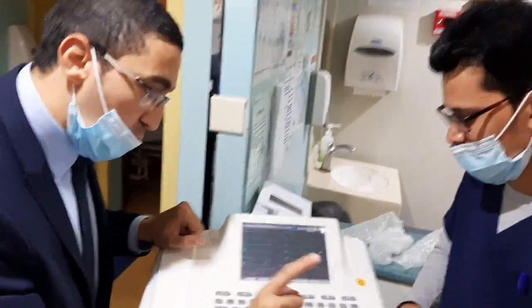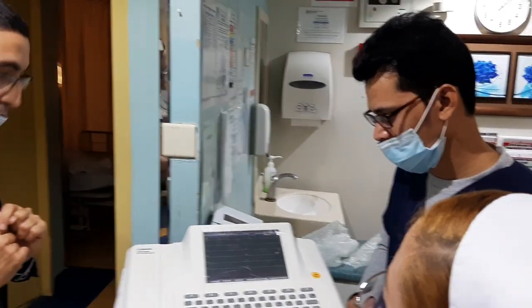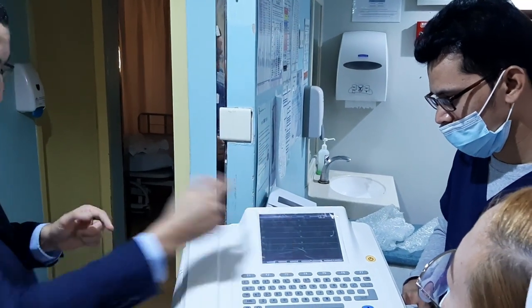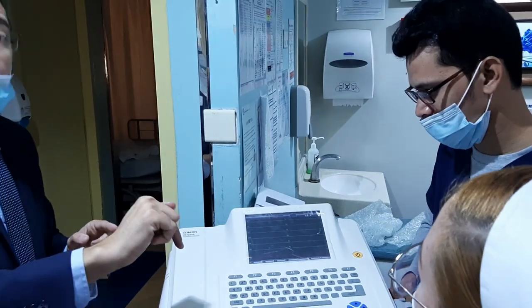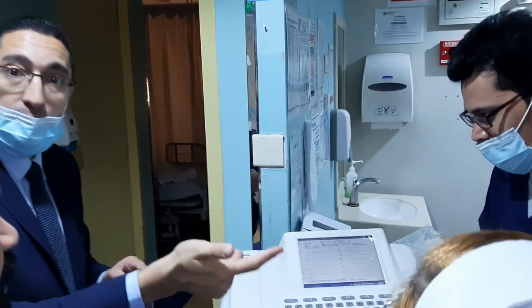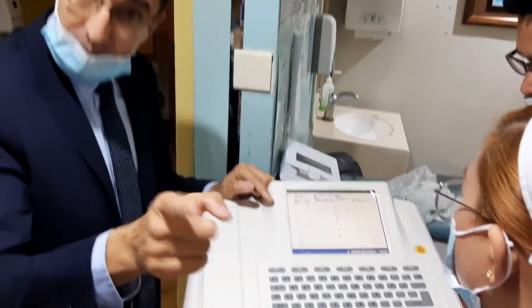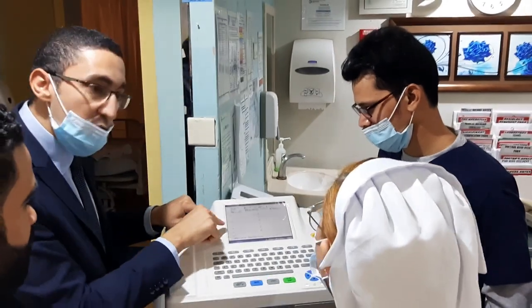As we told you, you make it by F5. You wait for 10 seconds, and it will give you the preview. I open the preview, same as on a computer. Not printed yet, only preview. It's not printed until you confirm. This is to save paper. It's like print preview in PDF or on a computer.